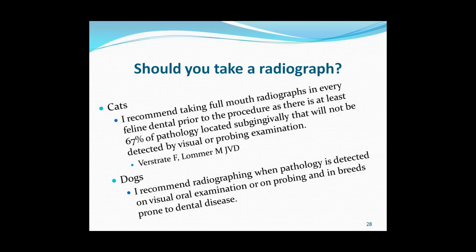Depending on who you talk to, some veterinary dentists recommend taking full mouth radiographs in dogs. I don't believe that we get enough pathology to justify the time and the amount of x-rays you produce, because you also need to think of the dogs being exposed to the x-rays, and your staff being exposed to the x-rays. So in our clinic, I recommend that we take radiographs in breeds that are prone to disease. So brachycephalics, for example, you could justify taking full mouth radiographs. Chihuahuas, like the smaller breed dogs, you could justify that.